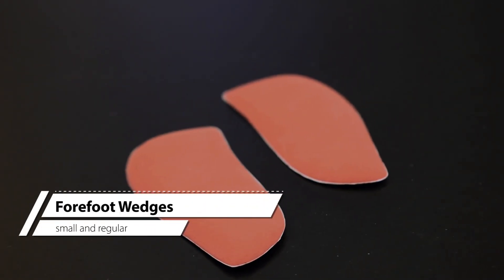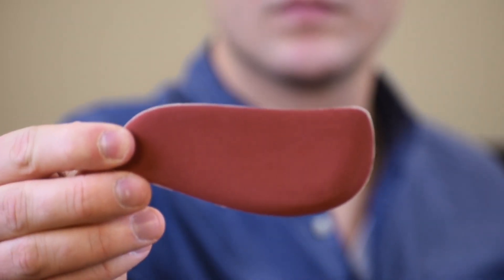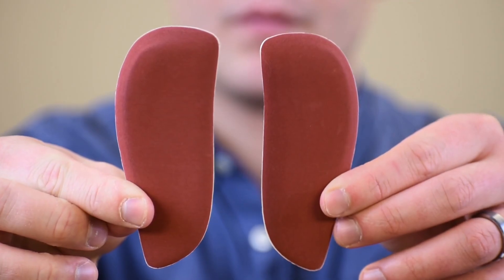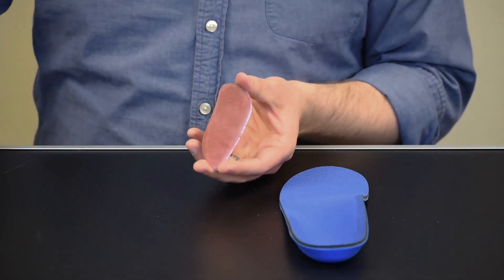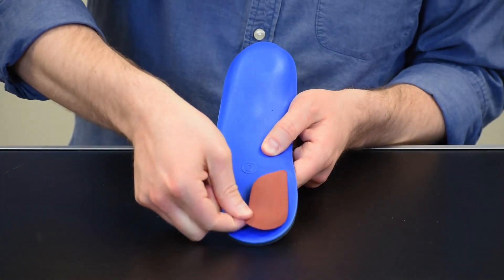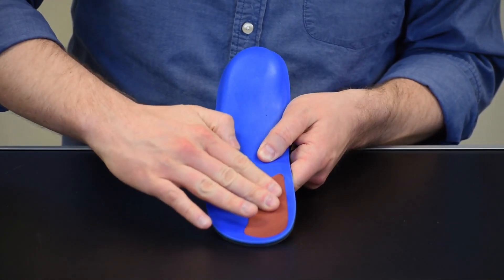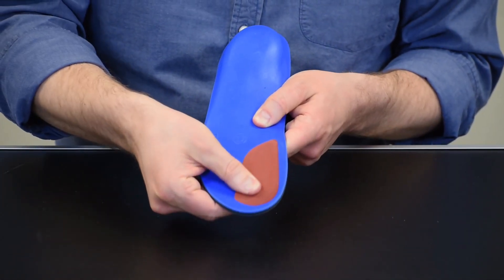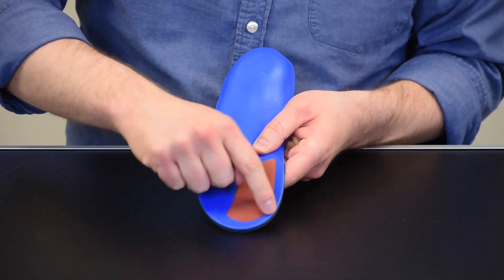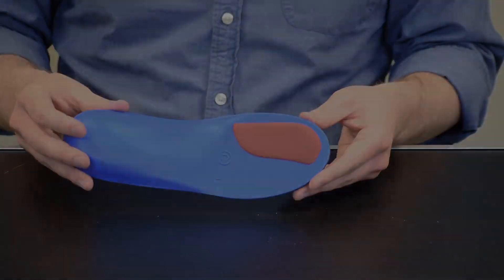Forefoot wedges are designed to account for forefoot varus or supinatus. These come in small and regular sizes and are left-right specific. To apply, select the correct size and side and remove the adhesive backing from the wedge. Attach on the bottom of the orthotic directly under the big toe. The thicker part should be on the medial side to provide medial support. The wedge should follow the edge of the orthotic with a one-quarter inch gap in between. Adjust the position as necessary for comfort.